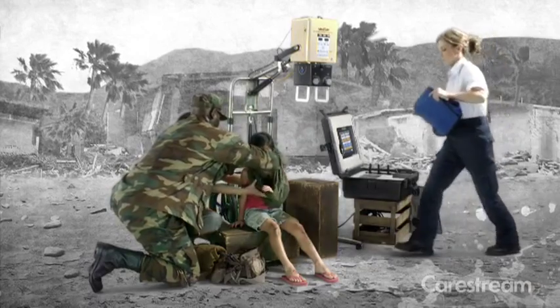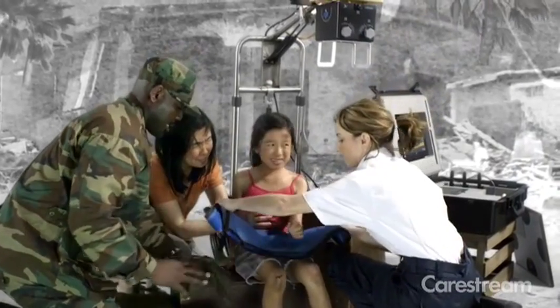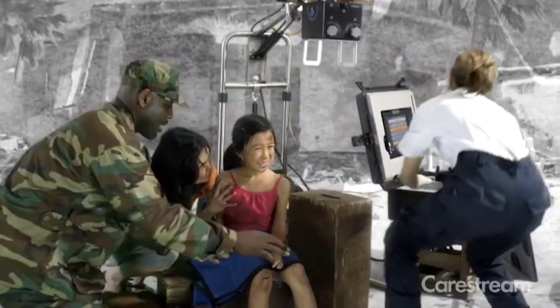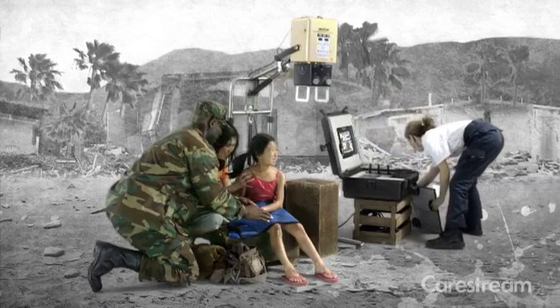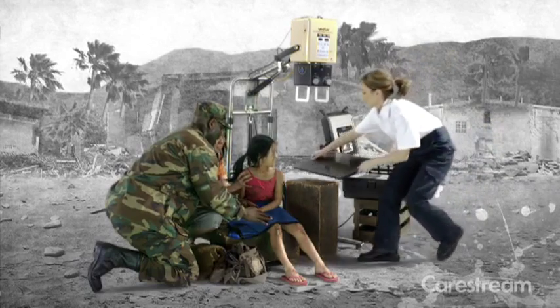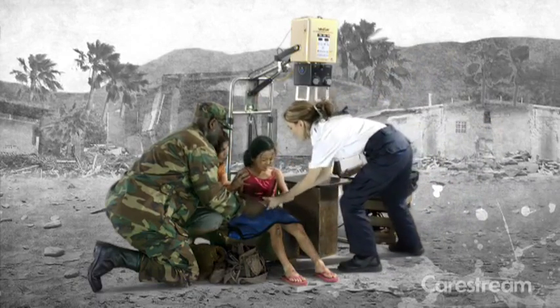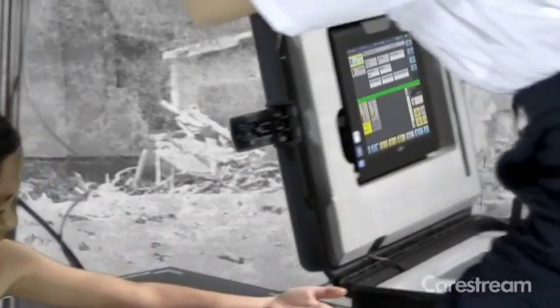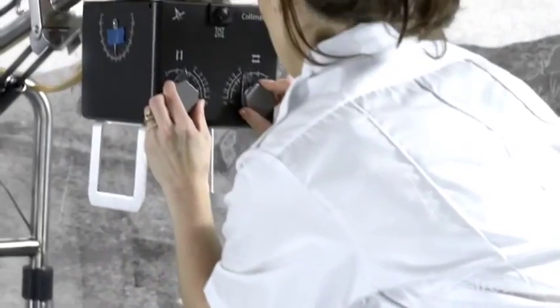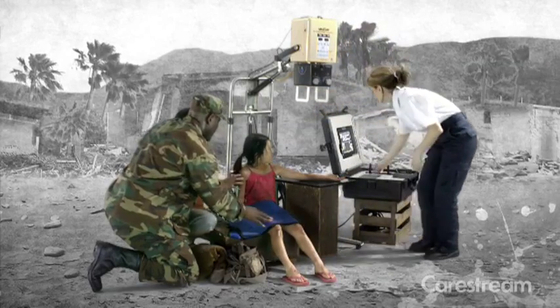In critical situations, you need quick setup and easy-to-use software. With our field portable unit, you add trauma patient information quickly and easily. Capture images without manipulation at the point of care. Our simple user interface minimizes training and provides fast workflow.